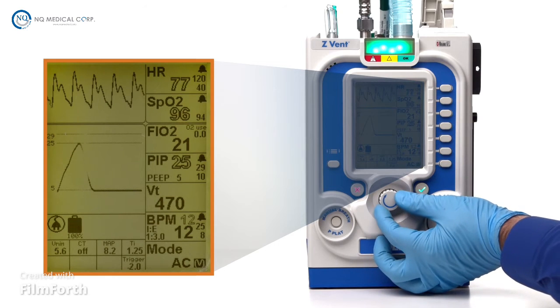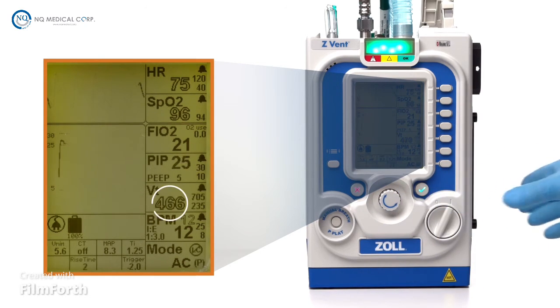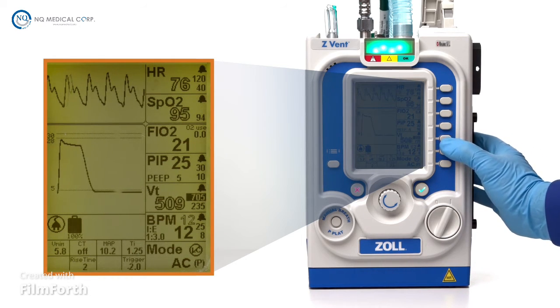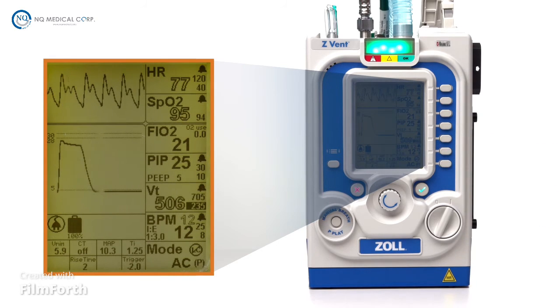When operating in pressure-targeted breathing mode, the tidal volume is a calculated value and will display as an outlined number that cannot be changed. However, the user now has the option to change the high tidal volume and low tidal volume alarm ranges. Press the parameter button once to change the high tidal volume alarm and twice to change the low tidal volume alarm.